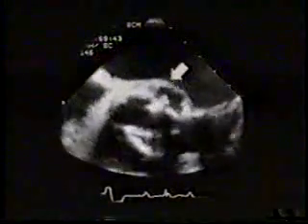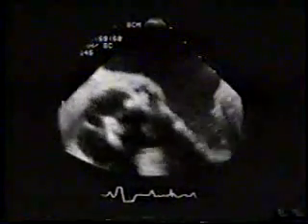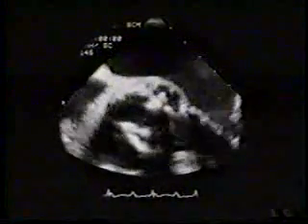This is an expanded view of the abscess cavity. This is a systolic frame which demonstrates mild mitral regurgitation. During ejection, the abscess cavity has filled with mosaic signals due to communication of the cavity with the aorta.